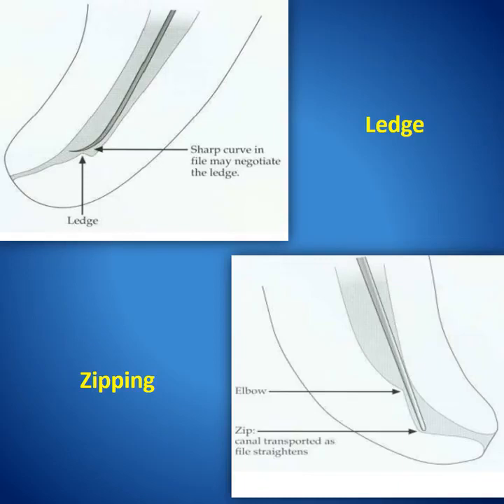That's why obturation will end up with certain areas that are unobturated or obturated with resorbable sealer. Another problem is blocking the apical area by debris. That's why it's important that the irrigation has to go with a lot of sonic or ultrasonic agitation.